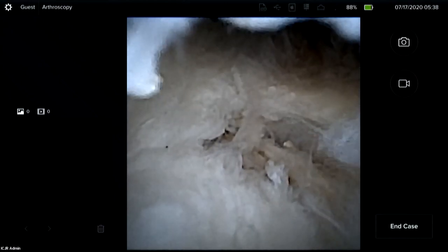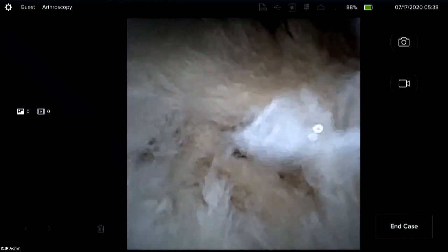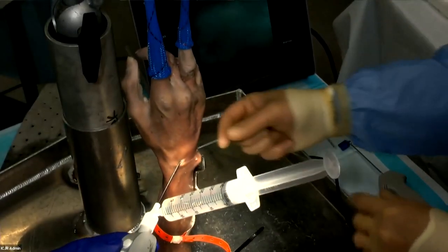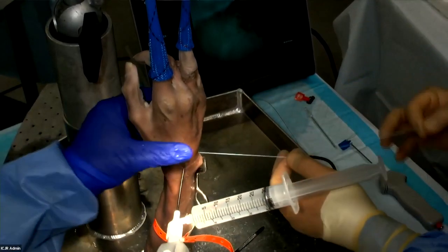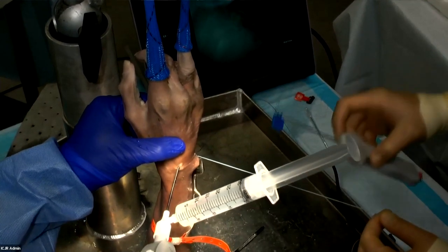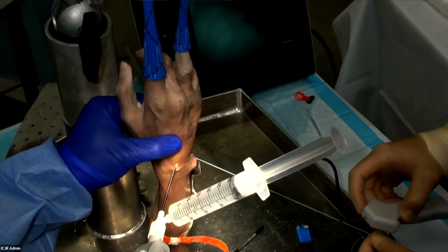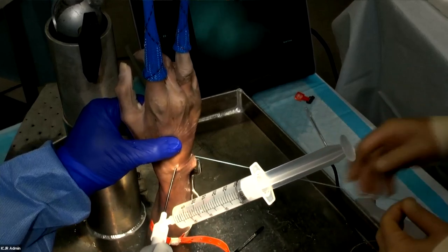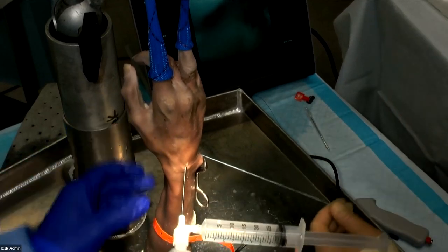The completion of the procedure is straightforward — similar to placing an anchor. We drill a hole in the ulna, pass the sutures through the eyelet of a SwiveLock suture anchor, then seat the anchor into the ulna. We can do this under the scope to show what it looks like.